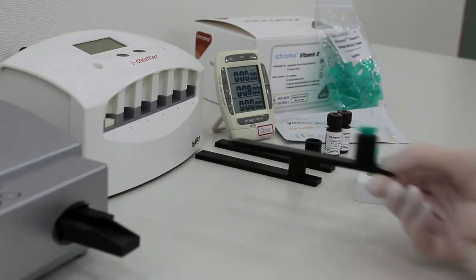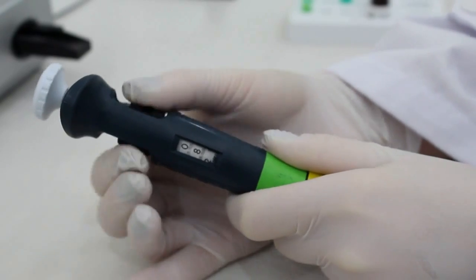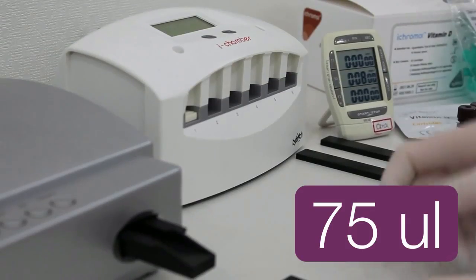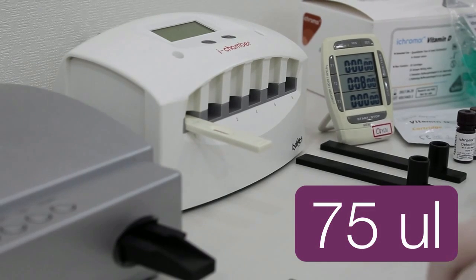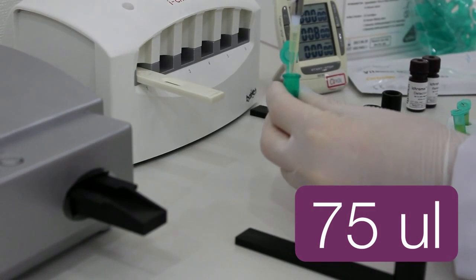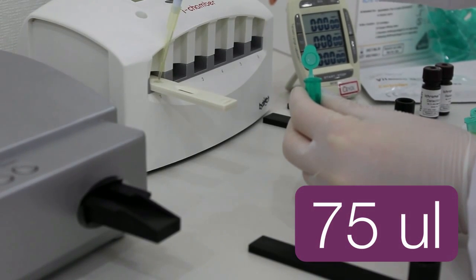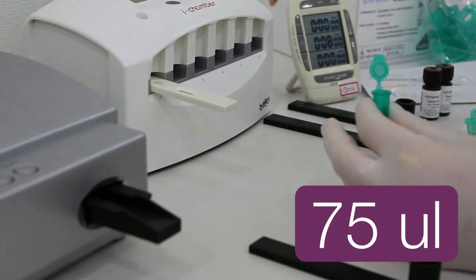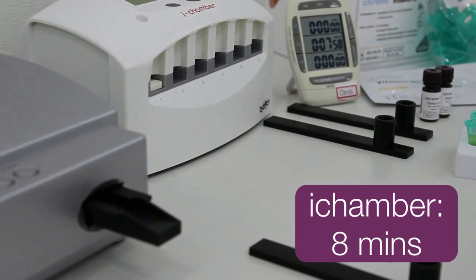After 15 minutes, pull out half of the test cartridge from the iChamber. Pipette out 75 microliters from the whole mixture, dispense it into the sample well on the test cartridge, and insert the test cartridge fully. Leave the sample loaded test cartridge at 35 degrees Celsius for 8 minutes.